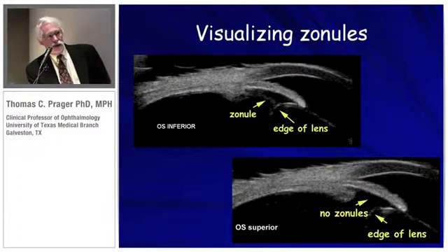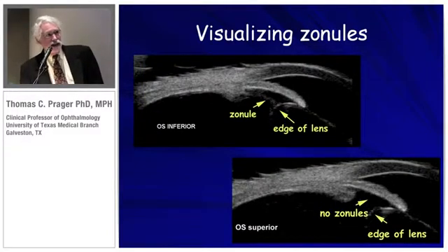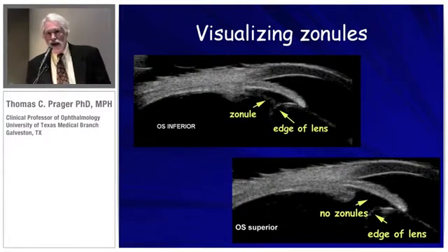In the superior aspect, there are no zonules. So this is what caused that lens to move so freely in the eye. You can see the cause and also know at which quadrant this was occurring.